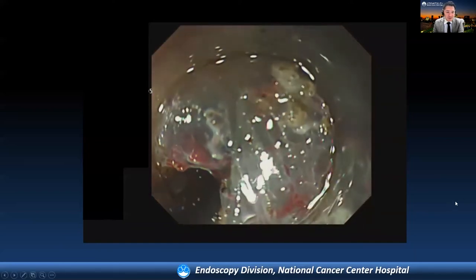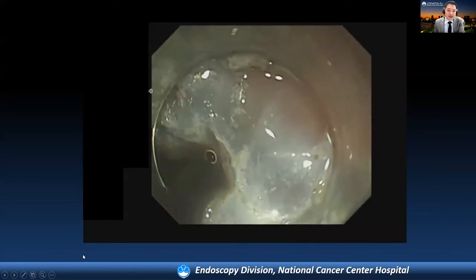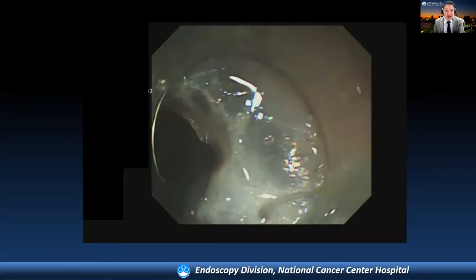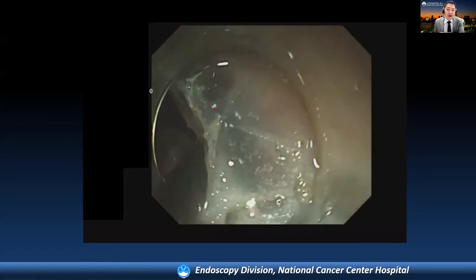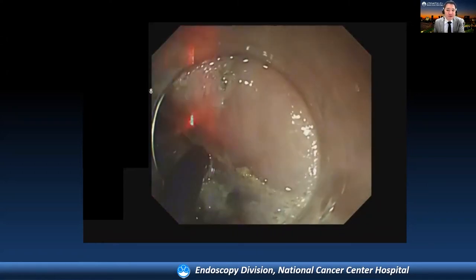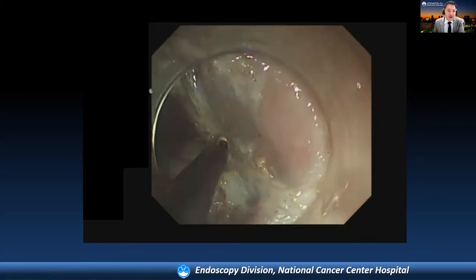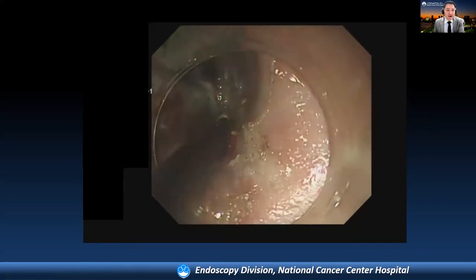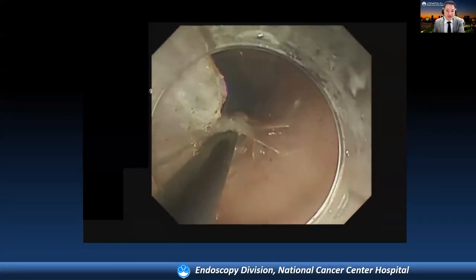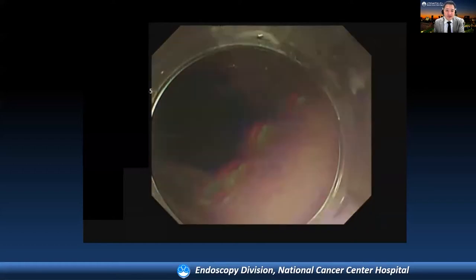We continued this procedure. Here you can see submucosal fibrosis owing to the prior EMR. We were able to dissect the submucosal fibrosis using the IT knife nano device, manipulating it parallel to the muscle direction. Finally, an en-bloc resection was achieved.